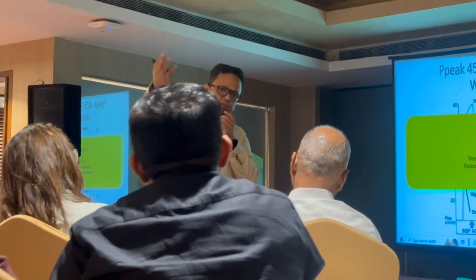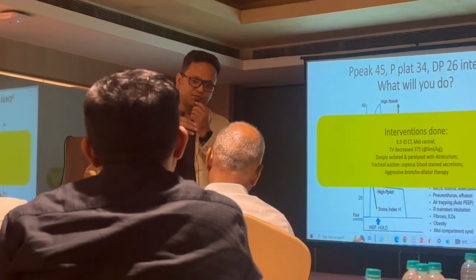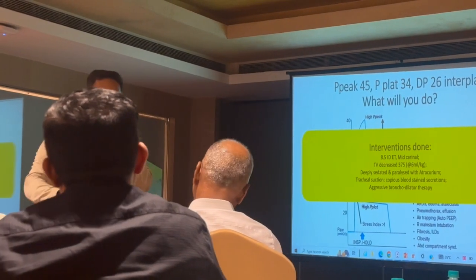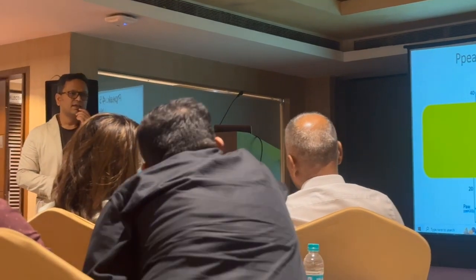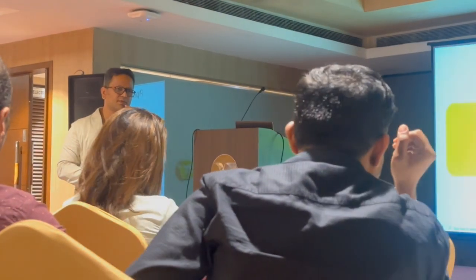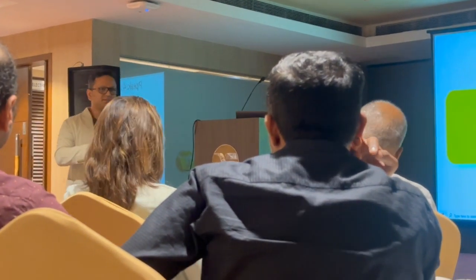I think you have said almost every point, but Dr. Sharma, if you find your patient to have a rise in both peak and plateau pressures, will you do the same or will you do something different? It's almost the same, plus you have done the sedation and paralysis. Yes, very good. You can sedate the patient and paralyze the patient. That will also control the airway pressure, the peak airway pressure. I think it's a very valid point.